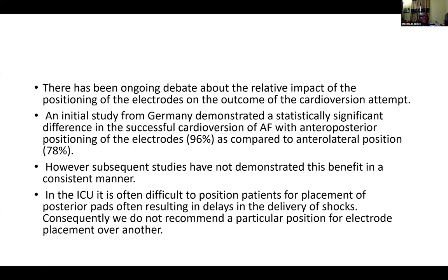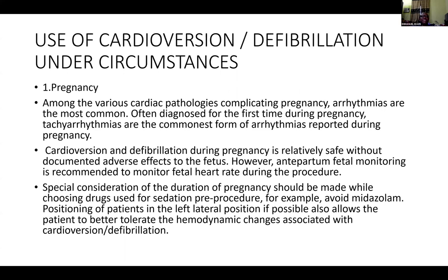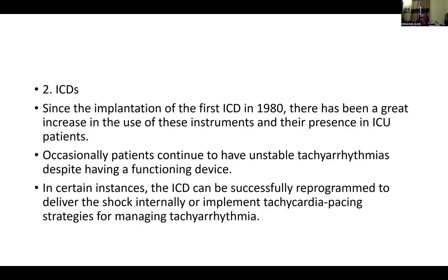Then we talked about the use of cardioversion or defibrillation under special circumstances like pregnancy or people with cardiac devices. Yes, you can do that. Among pregnant patients, you can do that, but as we said, the guideline recommends anterior-posterior, not anterior-lateral, for pregnant patients. Two, biphasic is preferable. Three, sedation is also very important. For an ICD or any devices, you can also do that, but avoid where the pulse generator is, so anterior-posterior is also very important. If they are fully conscious, you can sedate them before you go ahead with the procedure.